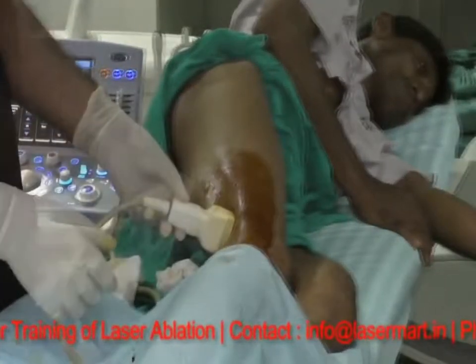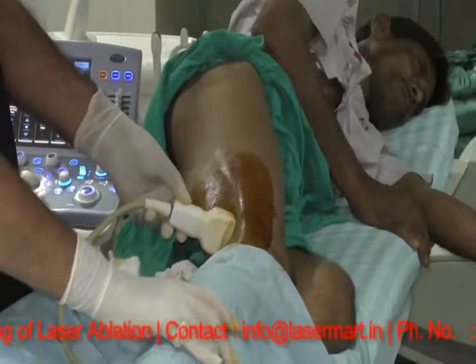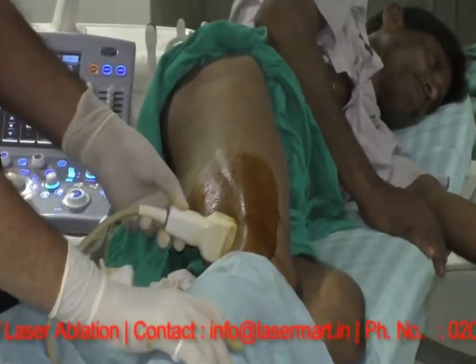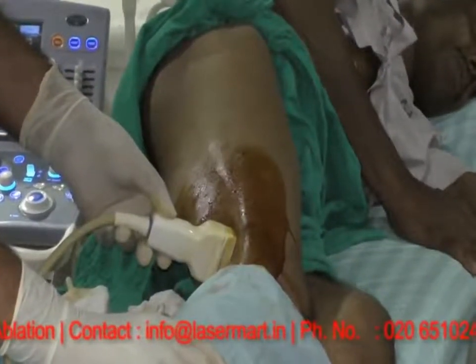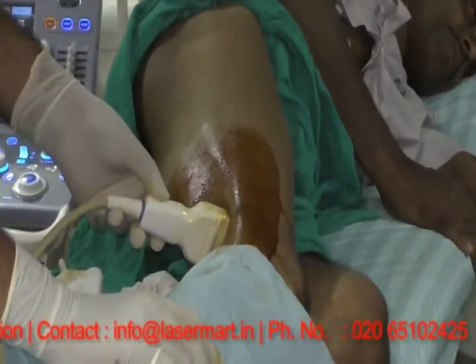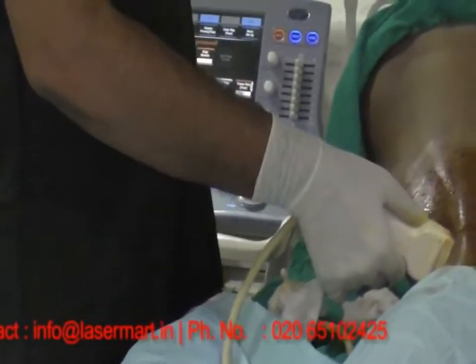We are in the right position. Just give a small squeeze into the hamstrings of the lower limb so that you will not be able to — you can see the gush of blood flow coming into the popliteal vein. So we have confirmed that this structure we are watching is the popliteal vein.